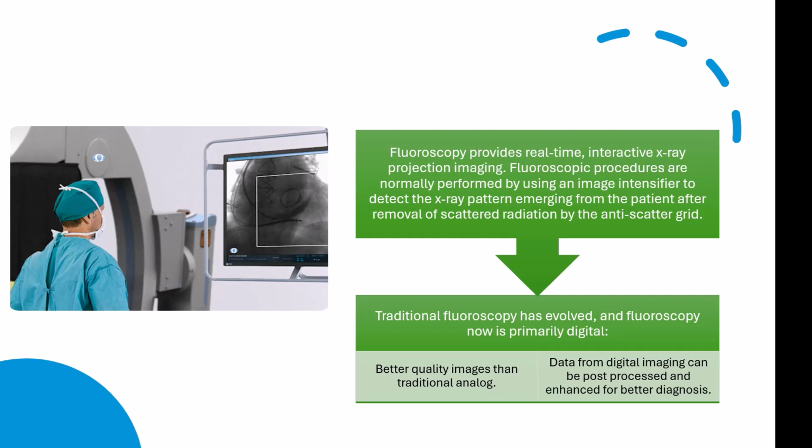Fluoroscopy provides real-time interactive X-ray projection imaging. Fluoroscopic procedures are normally performed by using an image intensifier to detect the X-ray pattern emerging from the patient after removal of scattered radiation by the anti-scatter grid. Traditional fluoroscopy has evolved and is now primarily digital.